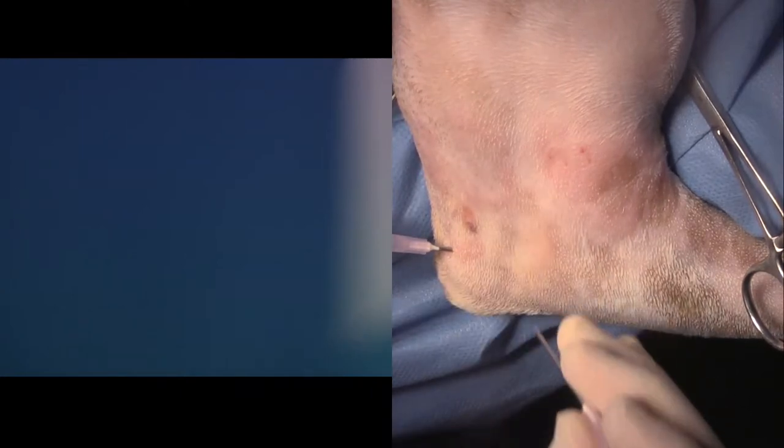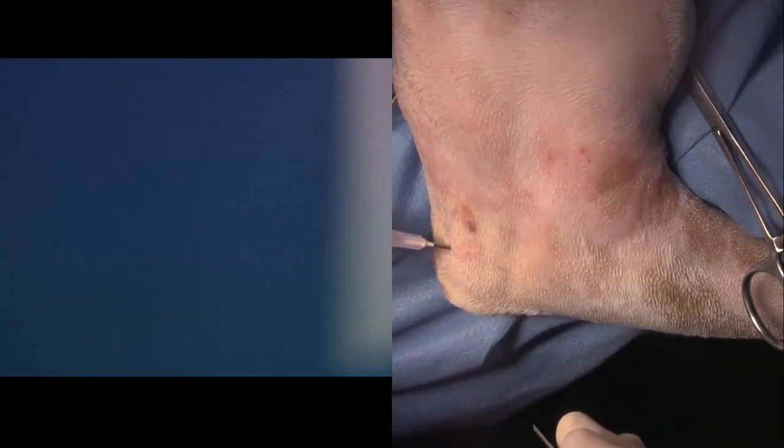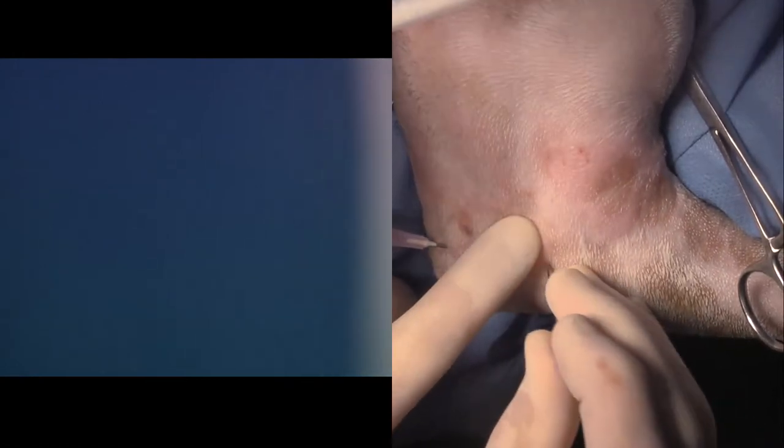So first thing we're going to do is attach a syringe and inflate that joint. And then I can palpate the epicondyle right here. So I'm going to be going in at about 5 o'clock relative to the epicondyle. James, can you come in here and just watch your head on the light handle and just inflate that joint for me? You're going to inflate it quite quickly. So we'll just feel and keep holding pressure there. And I'm going to go in right about there. And so you can see that we're in the joint.